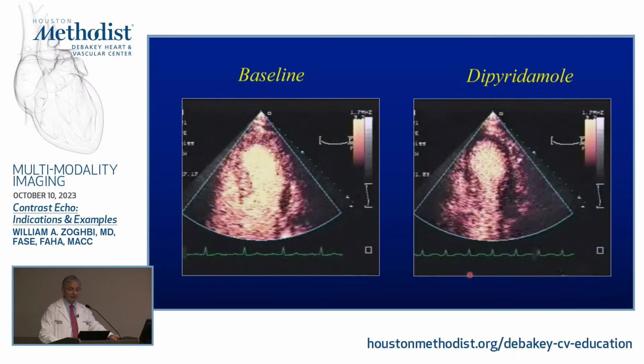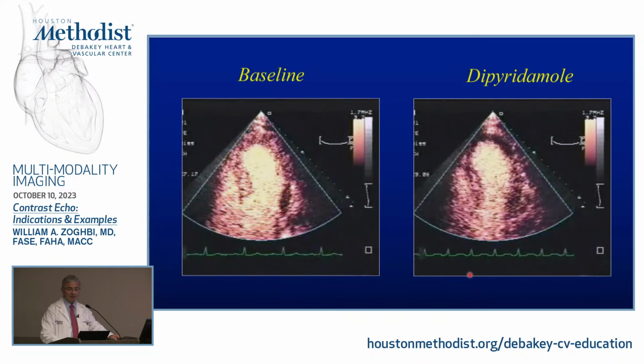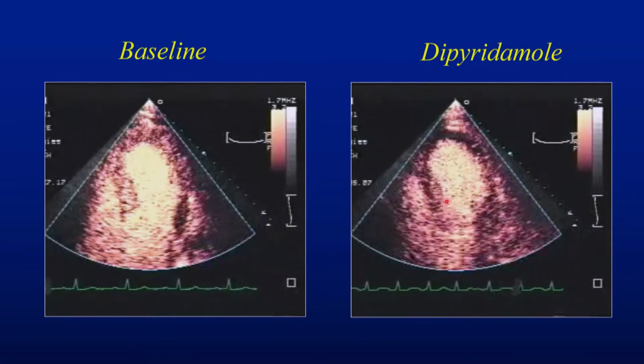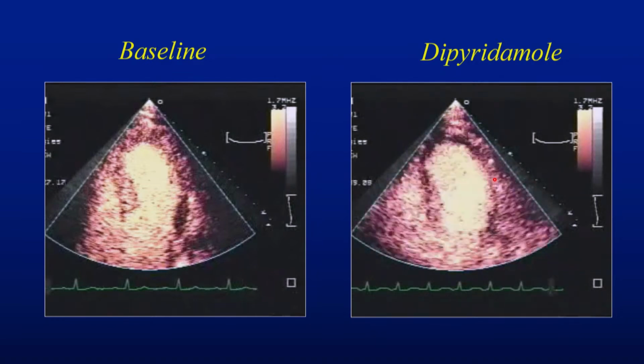And with dipyridamole, where you can increase myocardial blood flow, a high MI comes. It will be coming. There you go. And then you watch it fill. And obviously it fills much more here compared to the apex, where you have also a wall motion abnormality.